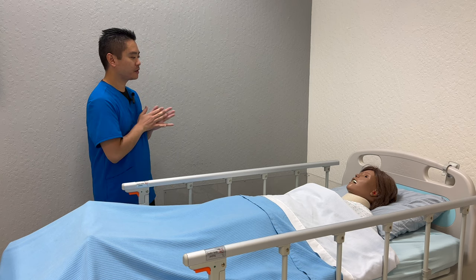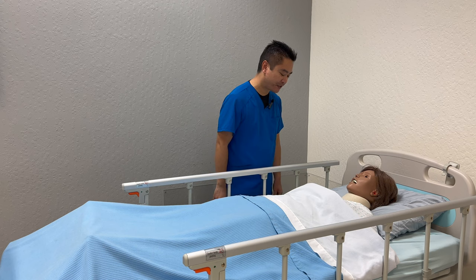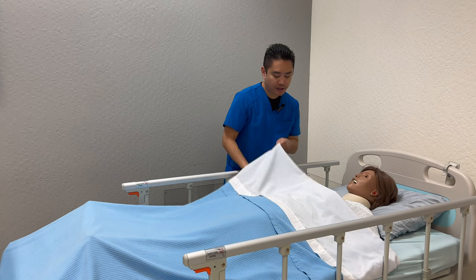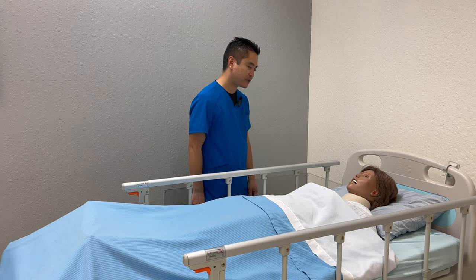Knock knock. Wash hands. Hello, my name is Xavier. I'll be your nurse for today. Is it okay if I check your name band? Ms. Smith, nice to meet you. I'll be providing catheter care for you. Is that okay? All right, so I'll be back with the supplies.